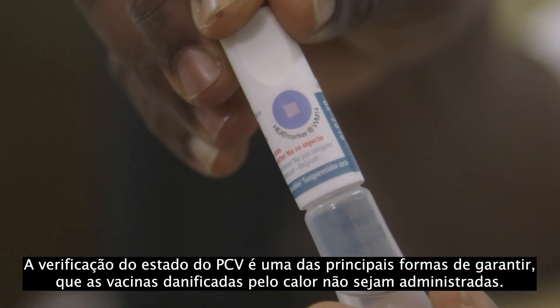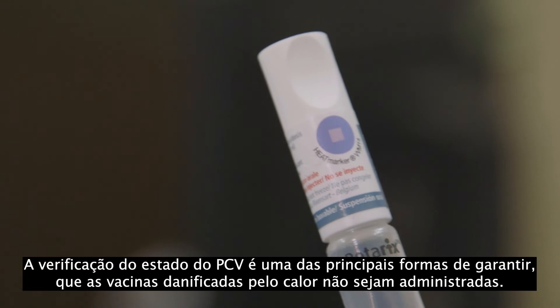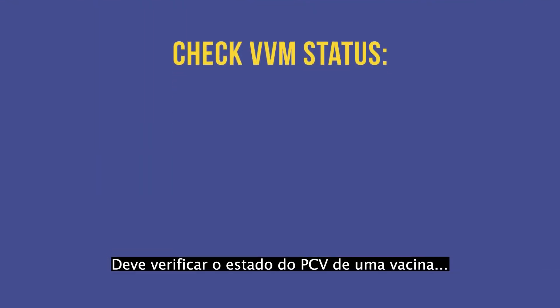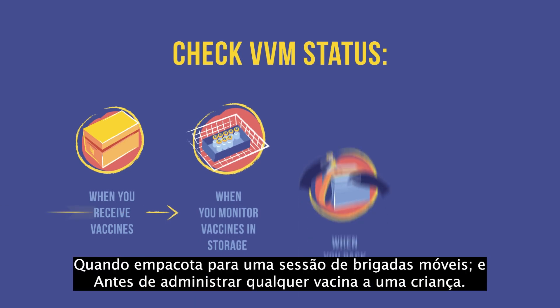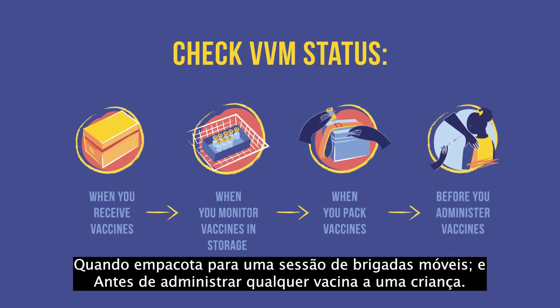Checking VVM status is one of the main ways to ensure heat-damaged vaccines are not administered. You should check a vaccine's VVM status when you receive vaccines at the health facility, recording VVM status on the arrival voucher, when you monitor vaccines in storage, when you pack for an outreach session, and before you administer any vaccine to a child.